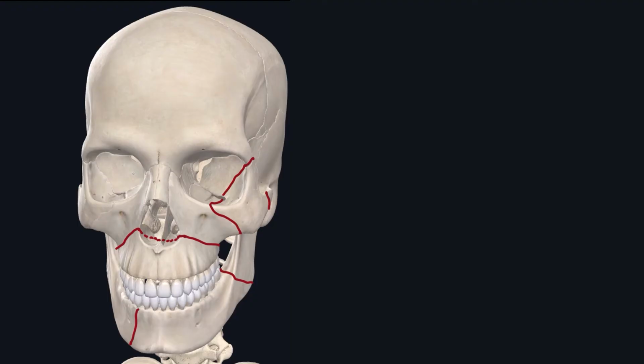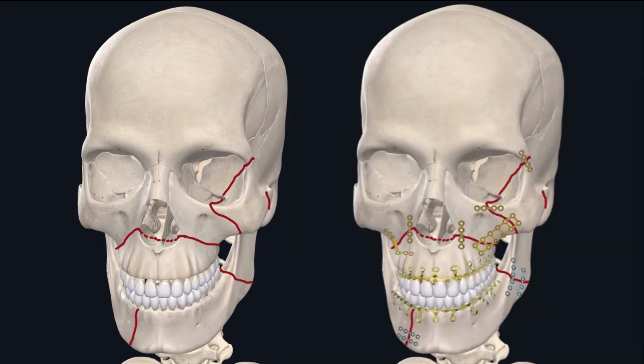So for a panfacial fracture case such as this, you can have a plate configuration that looks like this. And the important thing is you can have a wide range of correct plate configuration. And the important thing is to understand key principles that's unique to each subunit and select the type of plate that would provide optimal structural integrity at that location. Once you have your plate configuration figured out, your goal is to decide which sequence you're going to perform the plate application for all the plates you have decided to plate.